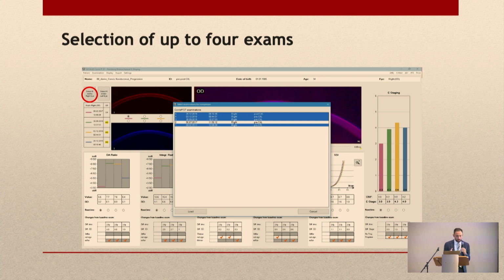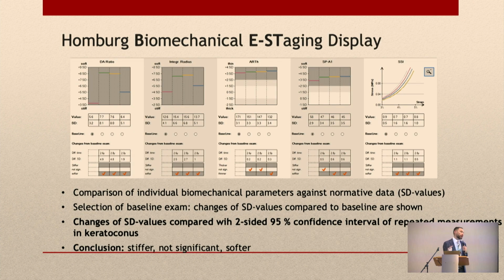And you can judge whether there is a significant progression over time with the E stages, and this is pre-op. Now we go back to what I was telling you before. So why do we need the other parameters? For 2 reasons. First of all, because you never bin something that you know to work when you add something.